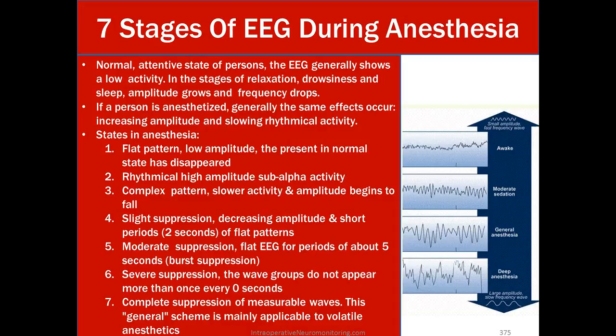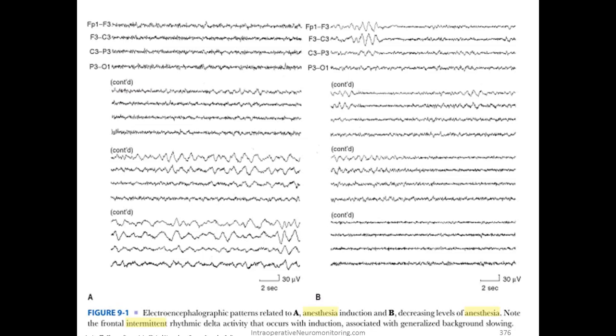This general scheme is mainly applicable to volatile anesthetics. And again, we have a graph over here showing from the awake to the deep in an anesthetized person.